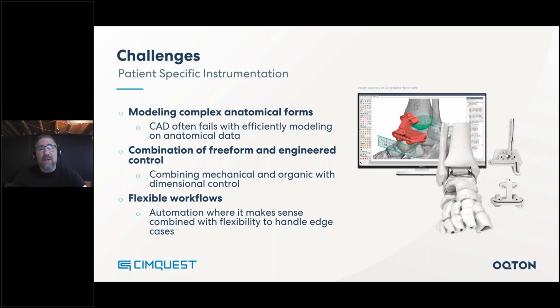Automation also allows you to remove some of the potential human error in repetitive designs and situations where you're doing things that are frequently done. You don't have to worry about it. We have seen times where small human errors go unnoticed, like a labeling error.